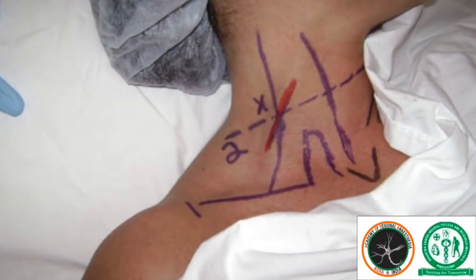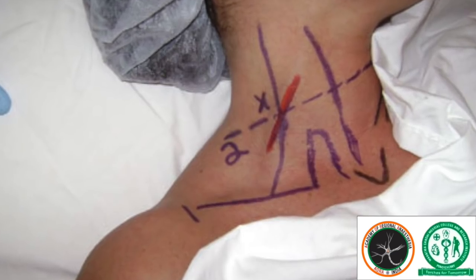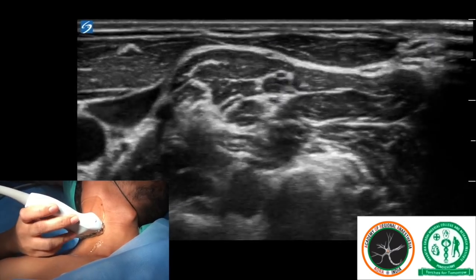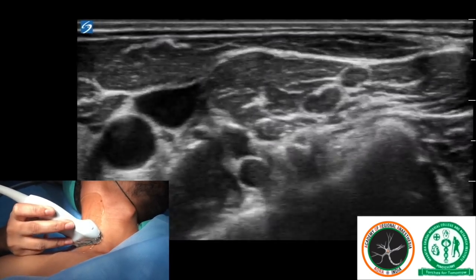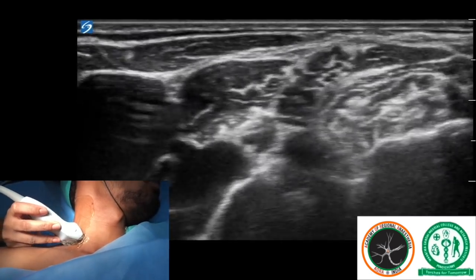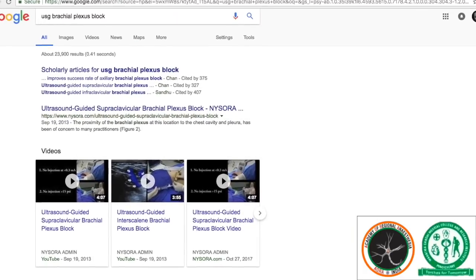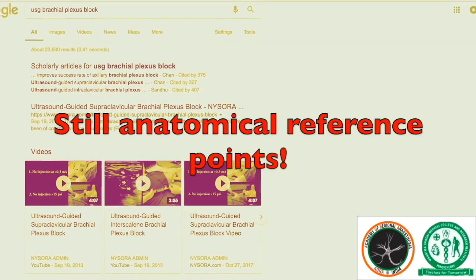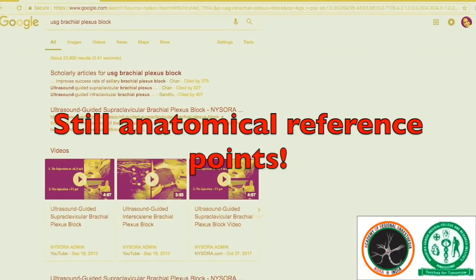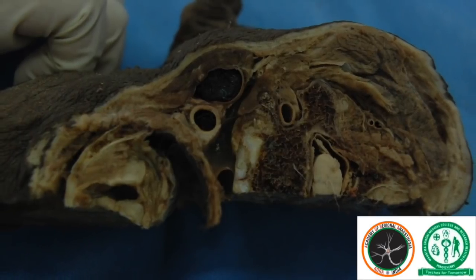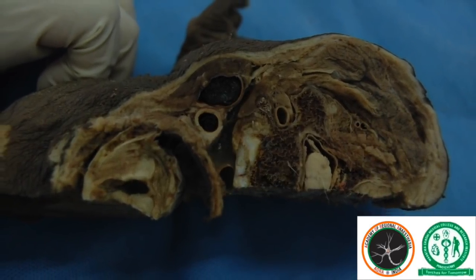In the era of regional anesthesia practice, prior to the use of ultrasound, we performed brachial plexus blocks above the clavicle with reference to anatomical landmarks like the interscalene groove or the pulsation of the subclavian artery. After over two decades of ultrasound practice, we have achieved clear visualization of these neural elements, but we are still continuing to describe these elements using vague nomenclatures like bunch of grapes, clusters, subfacial or extrafacial. This is essentially because there is a lack of corroborative evidence between the sonoanatomy and the actual anatomy.